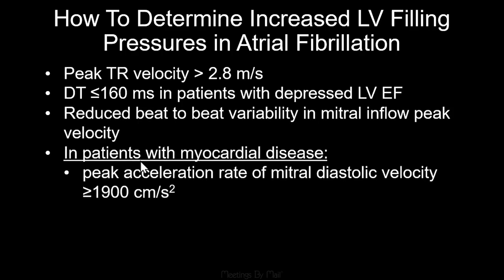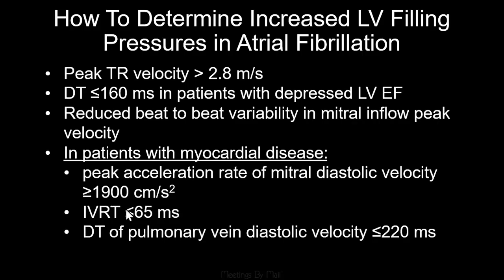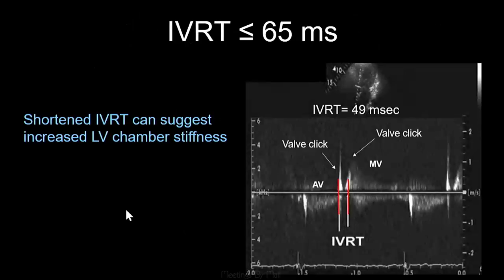We talked about some of these. I do want to emphasize some of these as well. I'll show these just as an image of what these look like. But we do have some supplemental parameters. I want to show how we assess those. So our IVRT, it sounds like, will be more encouraged in our newer guidelines.